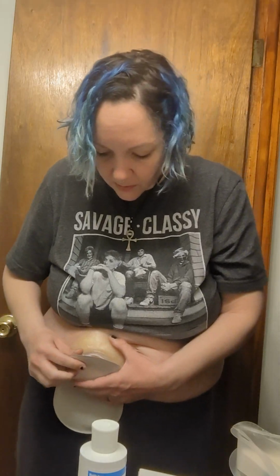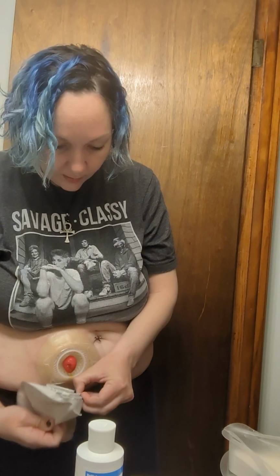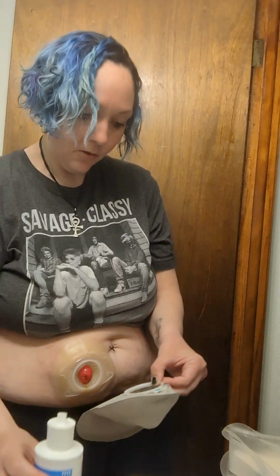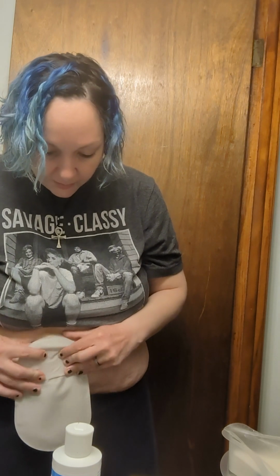I just want to share this part because this is what makes me feel extra secure. Hold up. Wait. So I'll be able to pop off a bag and pop another one on. Drop a little bit of that odor eliminator in there. I position my bag the way it's best for me. Everybody's different. Every person is different.